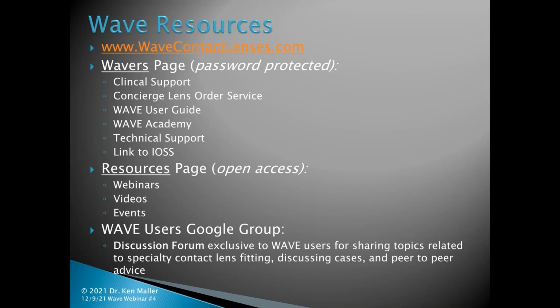In general, the thought process should be that the simplest design that gets the job done is the one you want to use. You do not want to add in unnecessary complexity. There's a phrase that I absolutely love and live my life by, not just designing lenses by: there's elegance and simplicity. And so you really want to take the simplest approach.